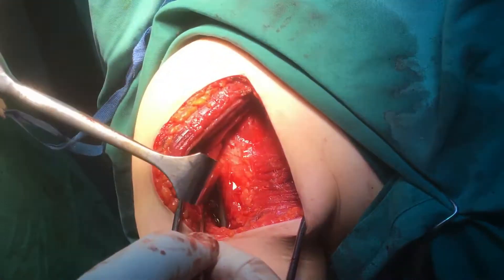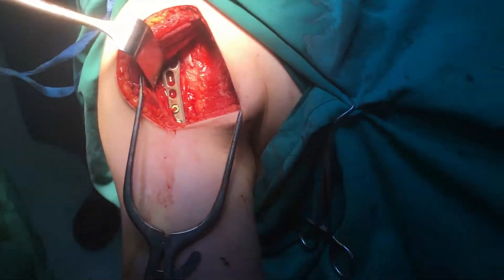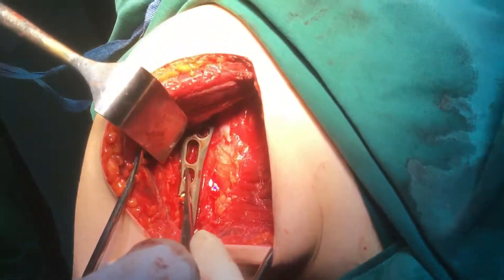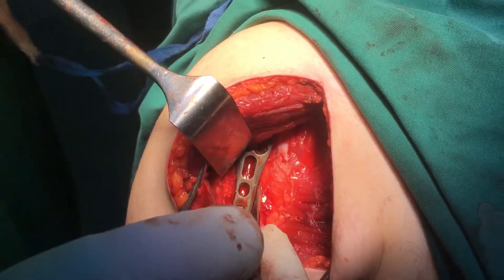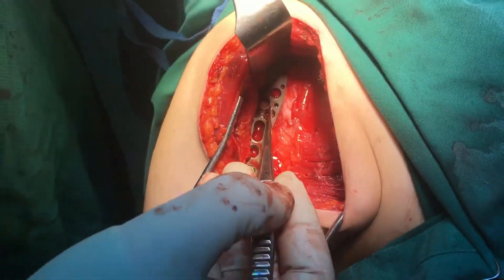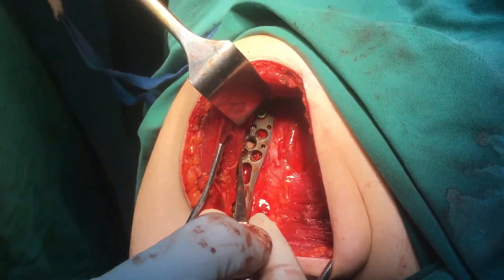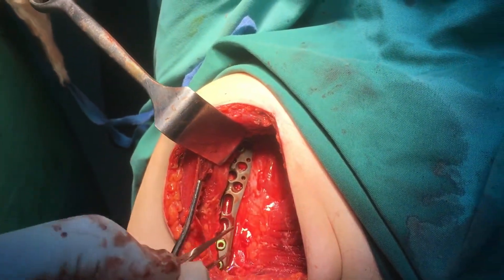We have here a bone cyst, and we did curettage for the bone cyst. And then we cover it with prophylactic fixation by Philos plate, as you see here. And this is the bone cyst in this area.